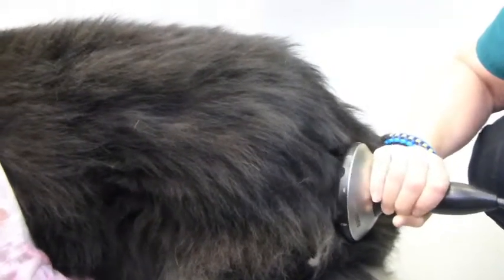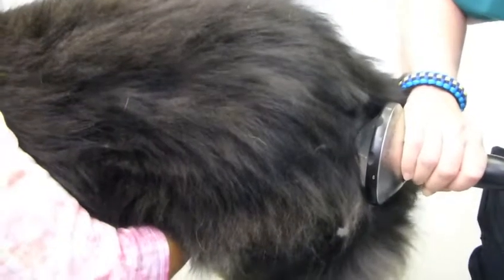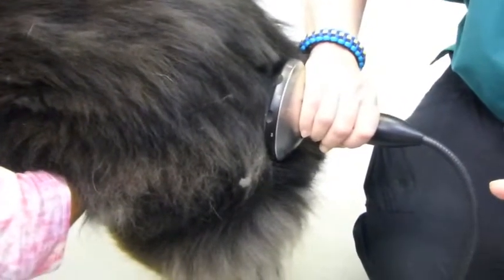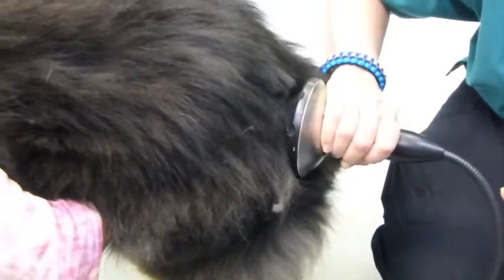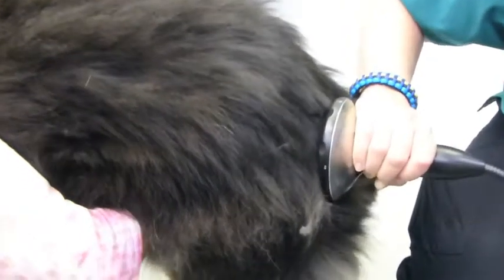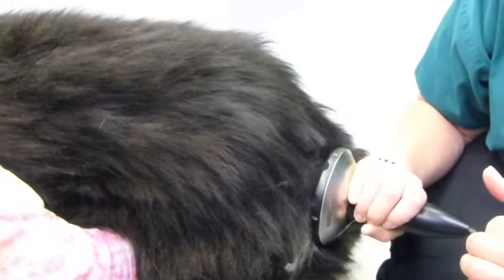I'm not sure when something happens to him back here, but I think he can tolerate it. We'll get a little bit of a touch. Right there. So we're just going to hold it there for 750 shots. This is the normal protocol — it's between 750 and 1,000 shocks. It took about 250, so I'm going to stop it at 1,000.